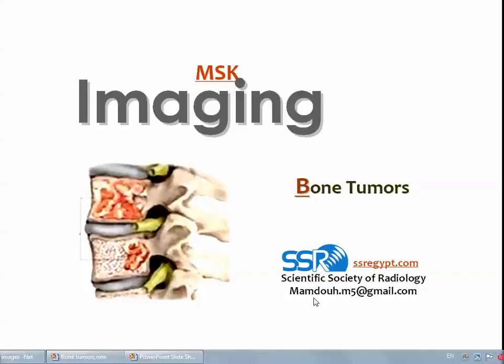Dear colleagues, now we will discuss the issue of bone tumors, which will be handled on two separate talks. The first one will deal with the technical examination and the way of interpretation of different imaging modalities, including X-ray, CT, and MRI. Then the second part will deal with the remaining topics in this issue.